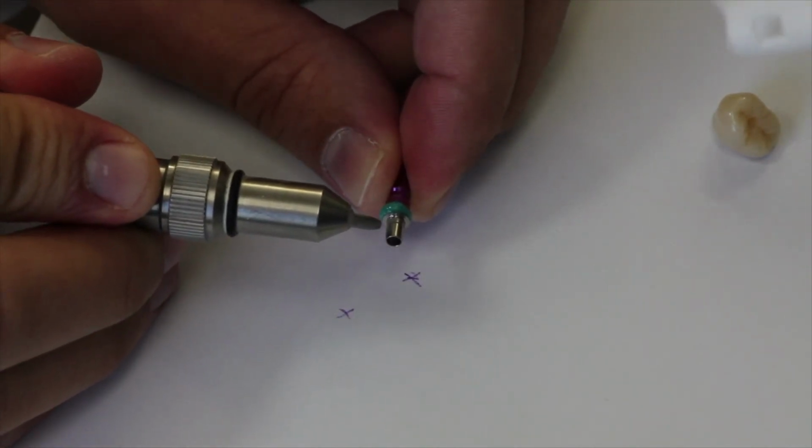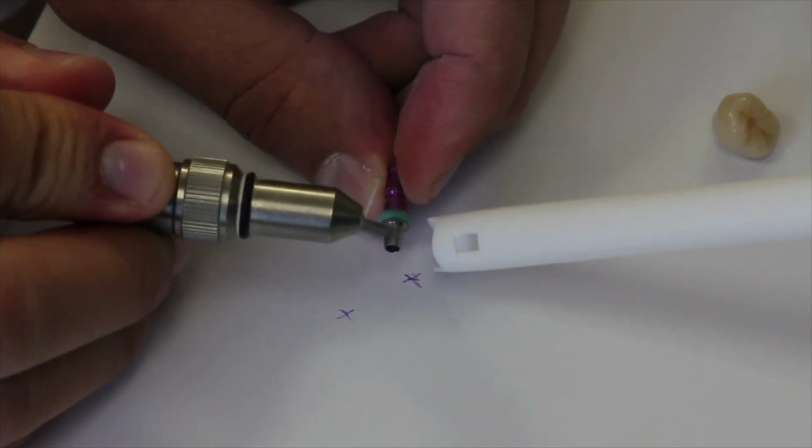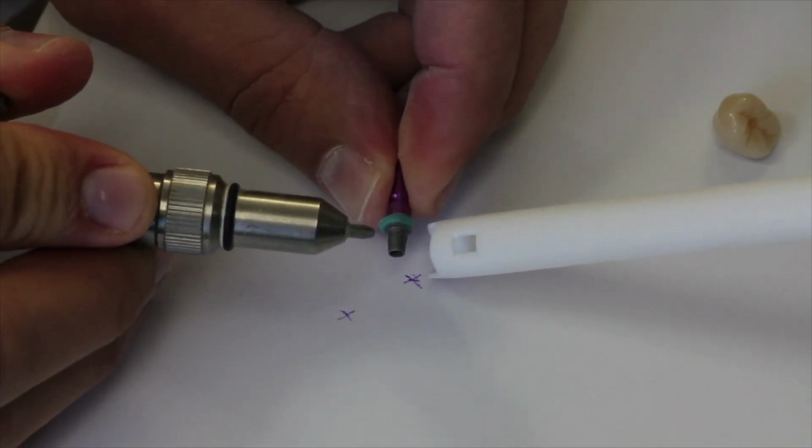This is a Danville microetcher, sandblasting the titanium base thoroughly to make sure you remove all the shine and dull it out. This will create a better bond with the Multilink Hybrid Abutment.